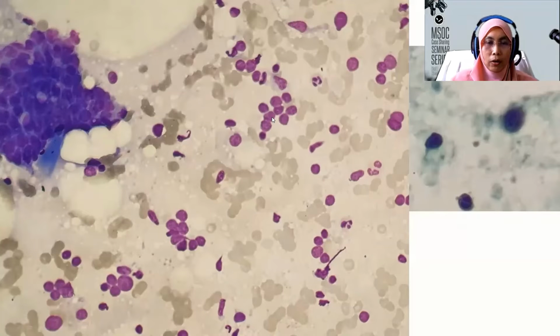It looks very atypical, but there is no cytoplasm attached to the atypical nuclei. So it looks larger with open chromatin maybe. So this is maybe the ductal cells, we don't know. This is on Pap stain. Also we can see larger bare nuclei without cytoplasm.